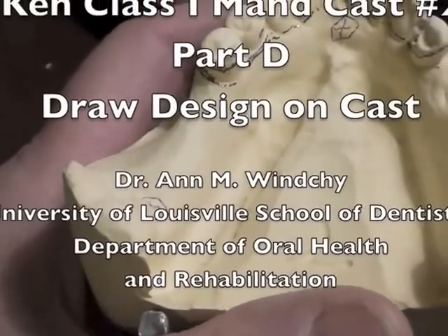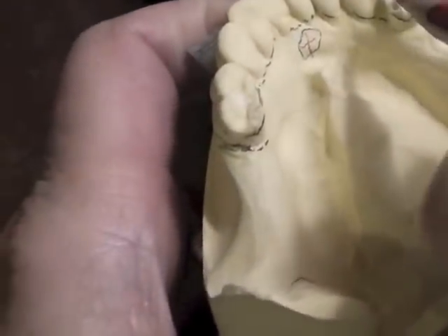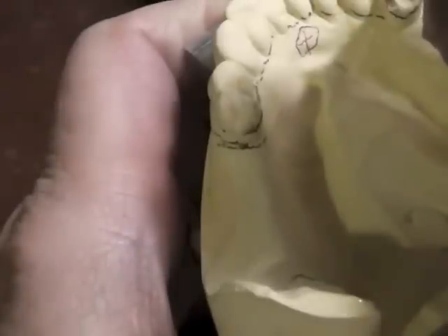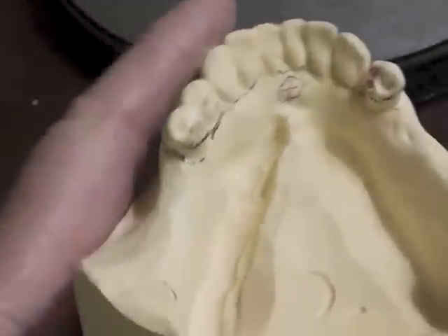We'll go ahead and start to place our design on the cast. We'll start with the clasp assemblies, and I like to put a mesial rest. We're going to do an eye bar on the premolar, so we would start with a mesial rest, and we're going to prep our teeth.